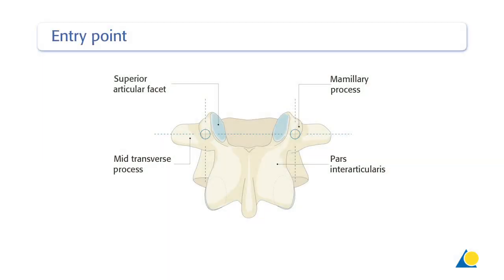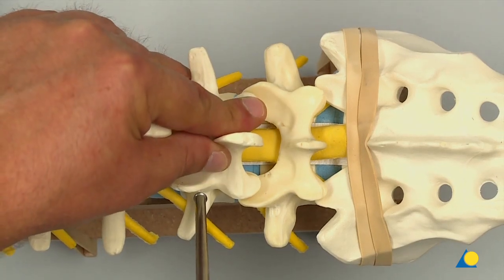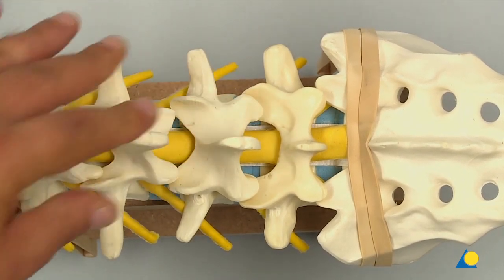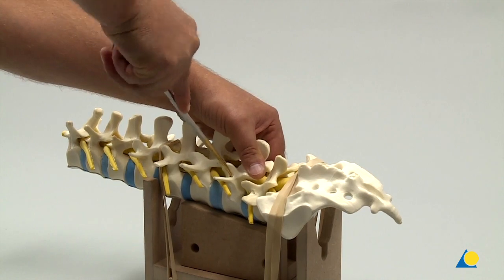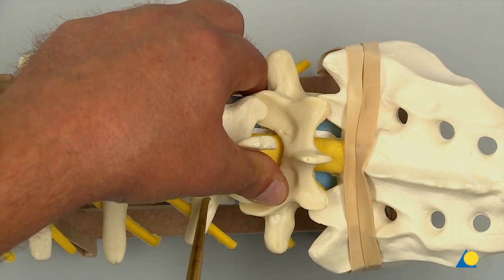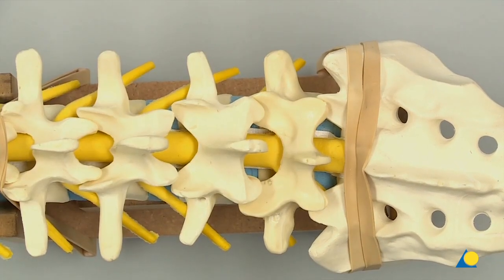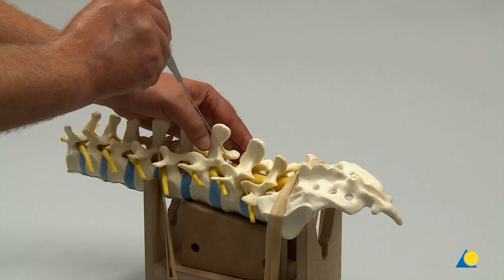The entry point for the pedicle screw in the lumbar vertebrae is in the midline of the transverse process and slightly lateral to the superior articular facet. The entry point of the thoracic vertebrae is at the mammillary process. The superficial cortex of the entry point is opened with a pedicle awl. A pedicle probe is used to navigate down the isthmus of the pedicle into the vertebral body. The appropriate cranial-caudal trajectory is perpendicular to the lamina, aiming to be parallel to the superior endplate. The depth and integrity of the medial pedicle wall is checked using the ball tip feeler.